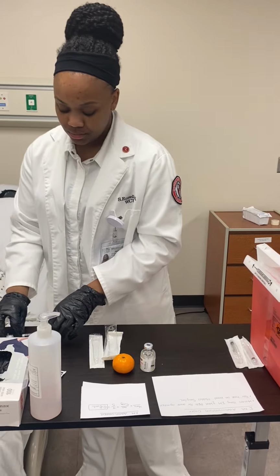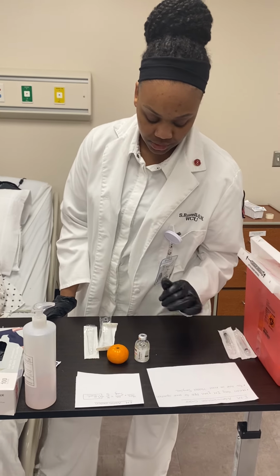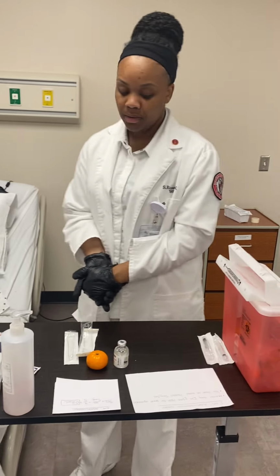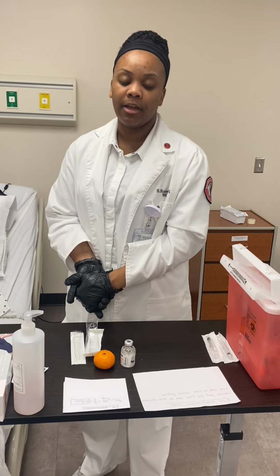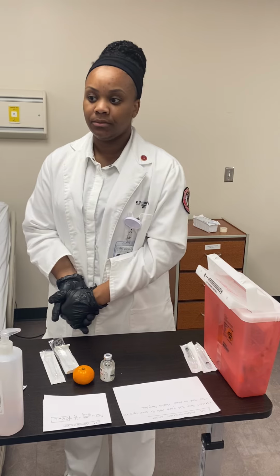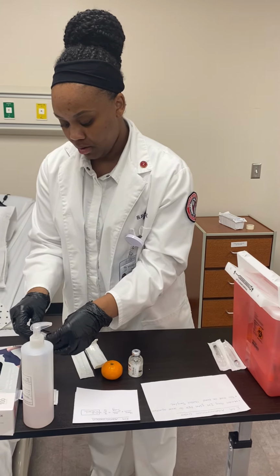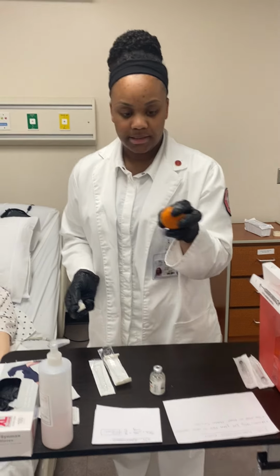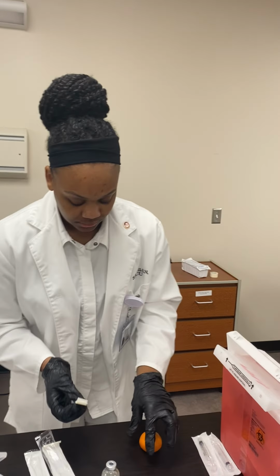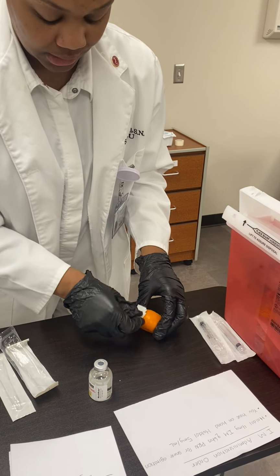Okay, so once I enter the room, I'll check the MAR again, making sure it's the correct medication. Then I'll explain the procedure to the patient, basically letting them know I'm getting ready to give them 0.8 mils of Haldol in their right deltoid. So I will grab another alcohol prep pad. This is the patient's deltoid. So I'm gonna go ahead and just cleanse the skin or wipe down with the alcohol prep pad.